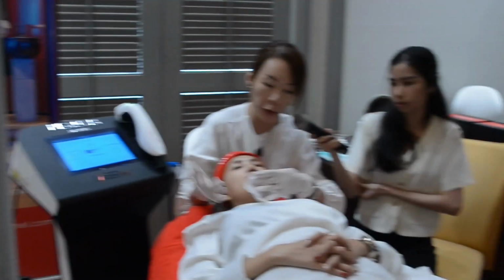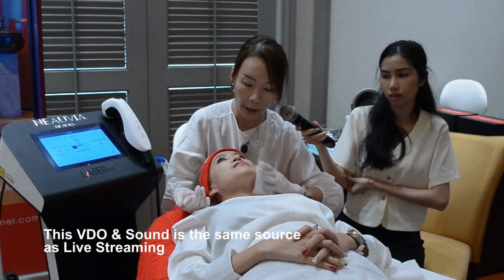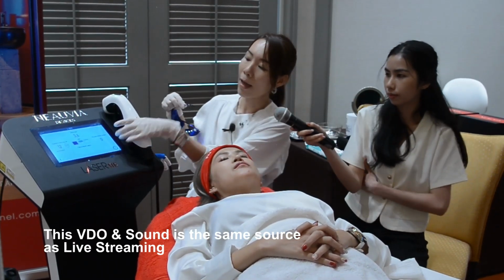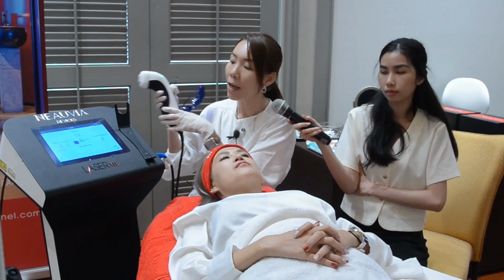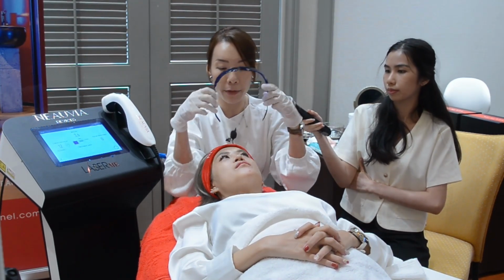Cleanse the patient's skin. She already removed her makeup, so I'm just doing an additional wipe off of any residual. Even though our handpiece has a very smart contact sensor whereby it will not shoot if you do not have full contact with the skin, we will still wear goggles for patient safety.